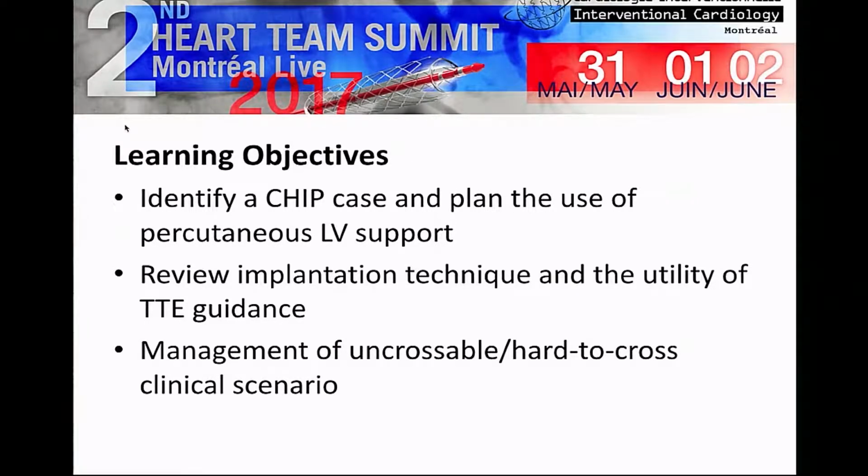So the objectives today are to identify a CHIP case, plan the use of percutaneous LV support, review implantation technique, and the utility of transthoracic guidance during percutaneous LV support deployment, as well as talk a bit about managing an uncrossable or hard-to-cross clinical scenario in the cath lab.